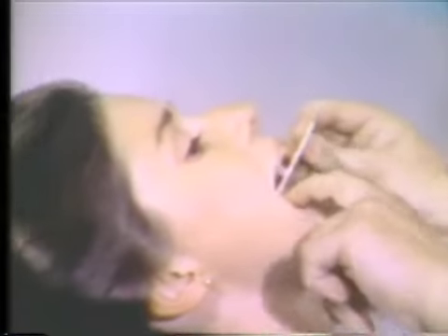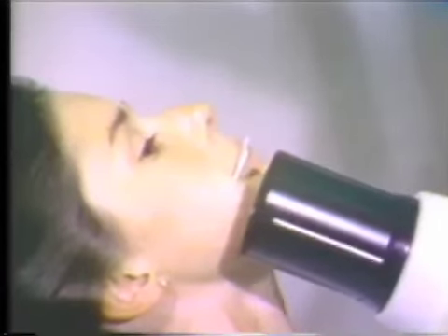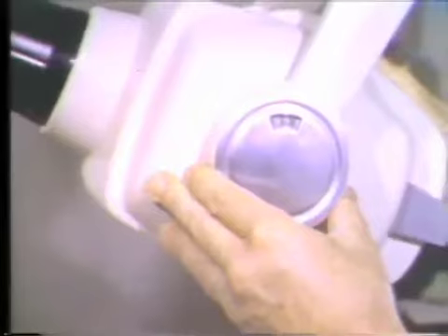With the patient's head tilted far back, the film is inserted and positioned as was illustrated on the typodont. The patient gently closes to hold the packet in place. The X-ray machine is moved into position, and the vertical angulation is adjusted so that the central ray is perpendicular to the film. Now the upward angulation is increased by 10 degrees to account for the distal inclination of the roots of the teeth.